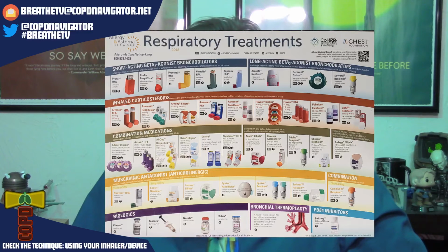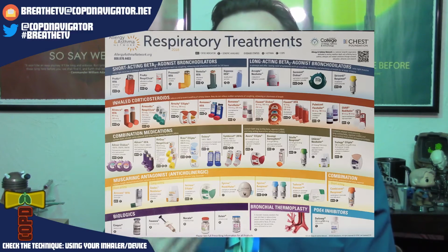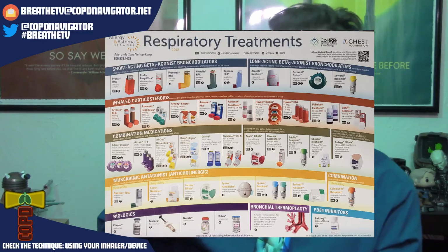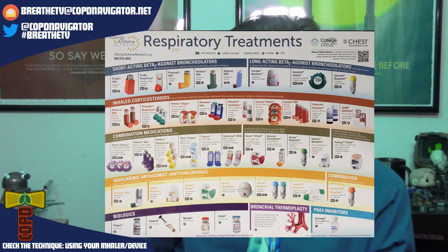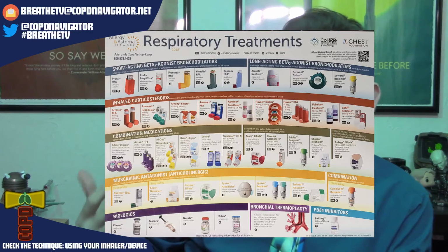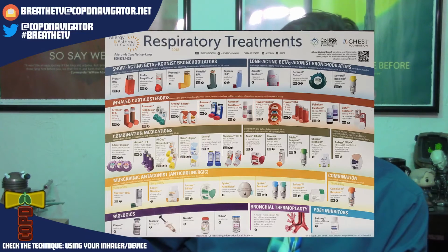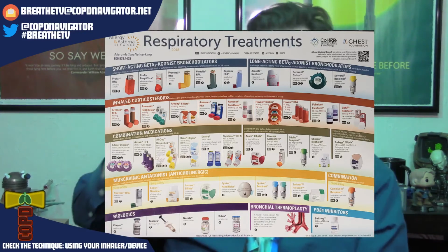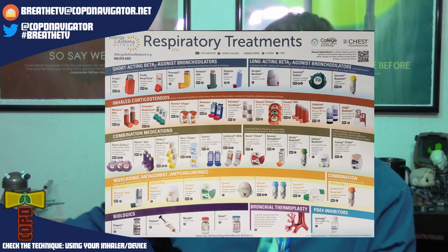There are all these things coming onto the market all the time. And each one of these has a somewhat different technique, whether it's opening the thing up, priming it, the inhalation flow, all that kind of stuff. And this doesn't even consider nebulizers. Nebulizers have their own quirks about cleaning and replacement of parts and things like that.